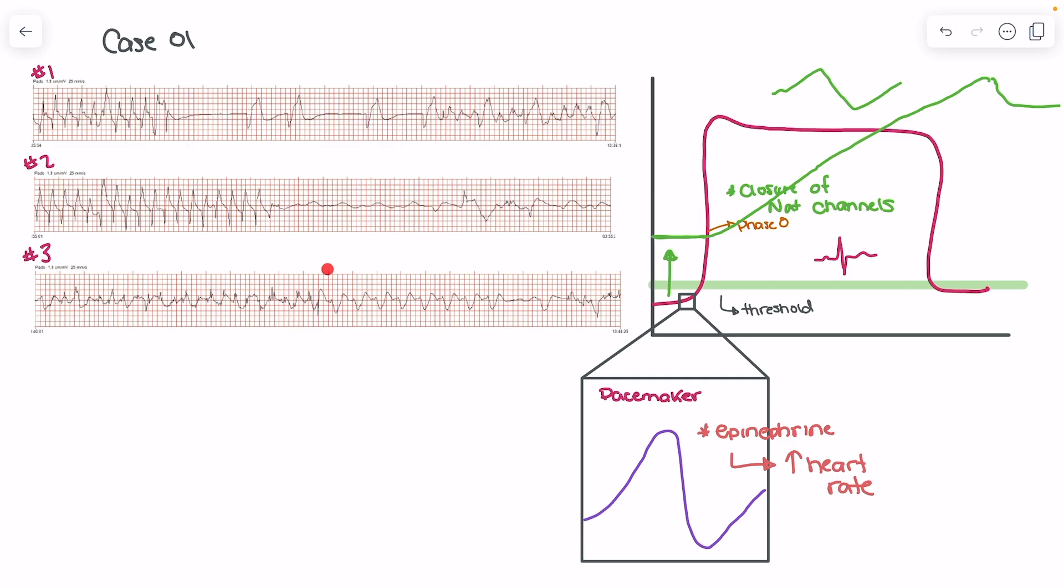And that is what we can see here, when we're looking at rhythm number three, this is still a rate under 100. So the rate here is 75. So we have a rate of 75. And we're seeing a wide complex. So it's still wide complex, it's still coming from the ventricles, but the rate is 75. So it's not a ventricular tachycardia. So this still could be considered the pathological rhythm associated with your hyperkalemia.